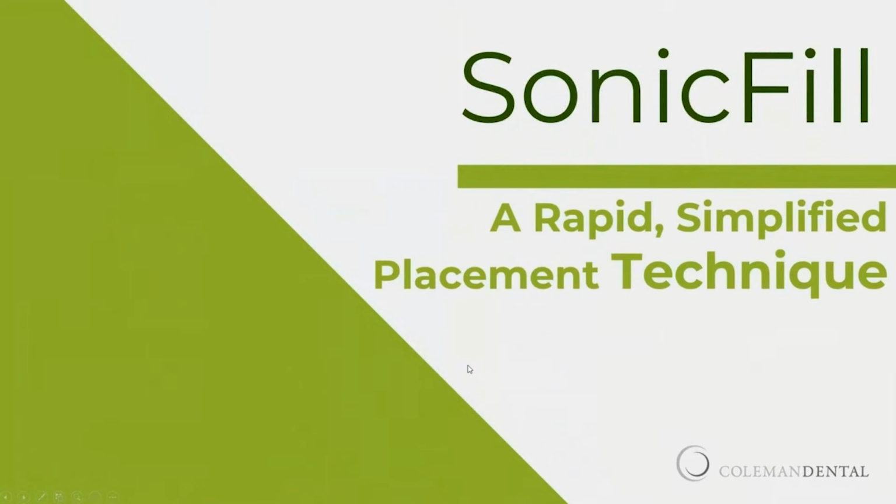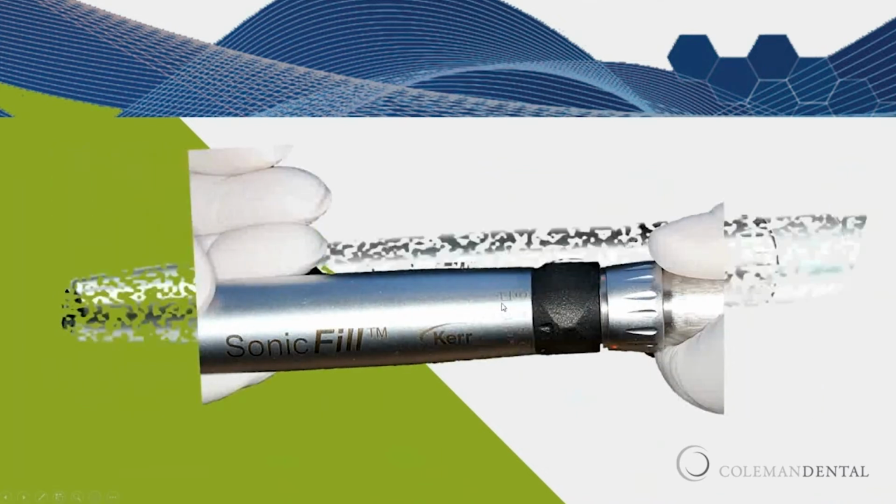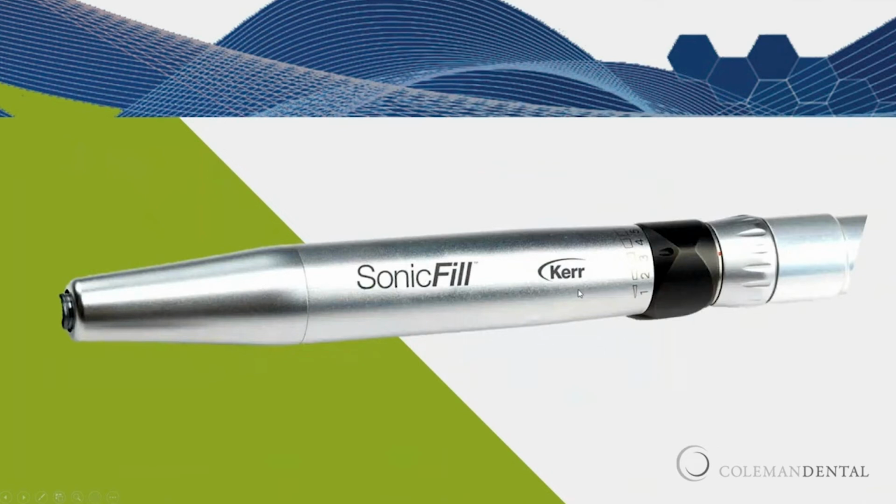So it's a rapid, simplified technique. It works off of a multi-flex coupler. The handpiece does. I keep it on my unit all the time, basically. So if you've got any kind of air-driven handpiece, this coupler screws into that. You fit your handpiece onto that, and then you're ready to go. That's all it is to it.